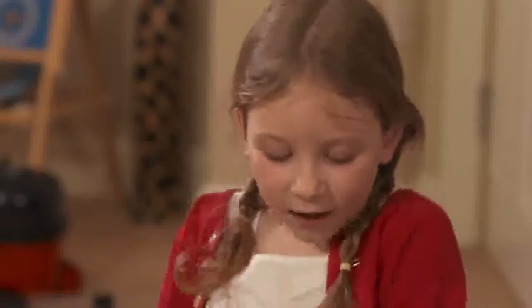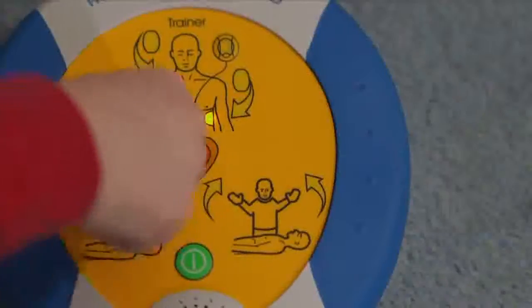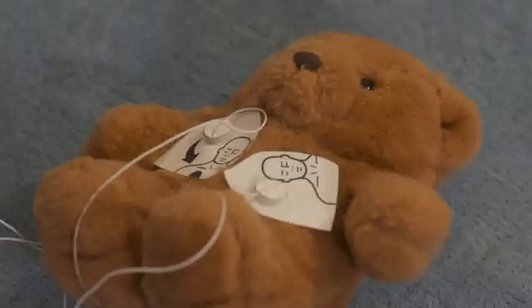Stand clear of patient. Shock advised. Press the orange shock button now to save Teddy. Shock delivered. It is safe to touch the patient. Teddy's alive!